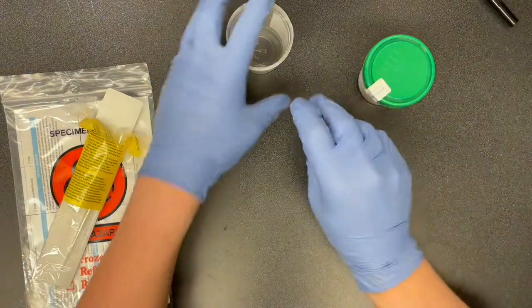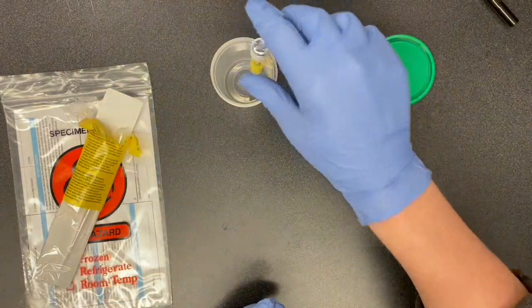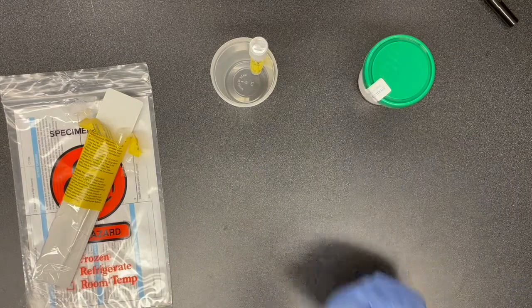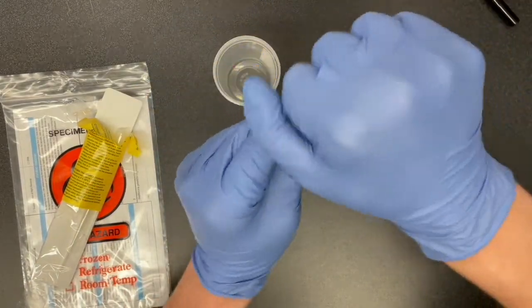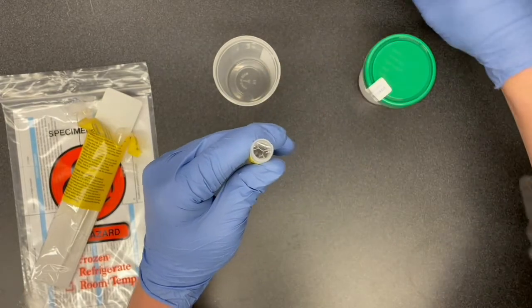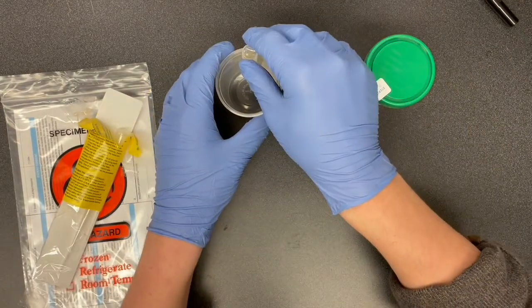Now, it can be useful to have another cup like this to stick the test tube in so that when we open it, it doesn't fall over. So first, we're just going to unscrew the cap, stick it in a cup like so.